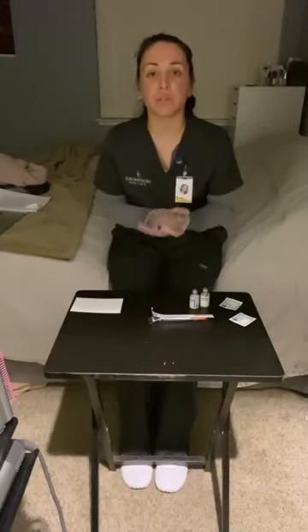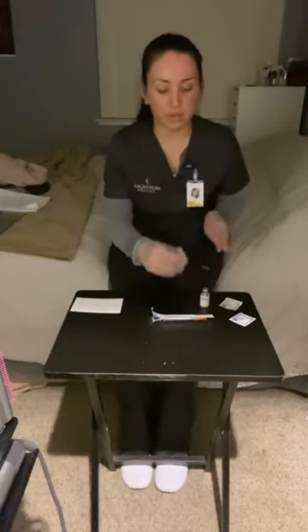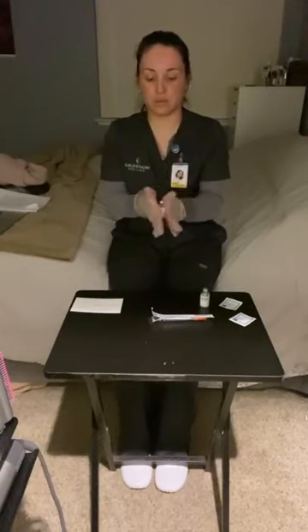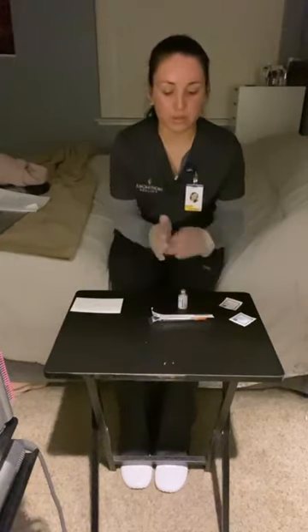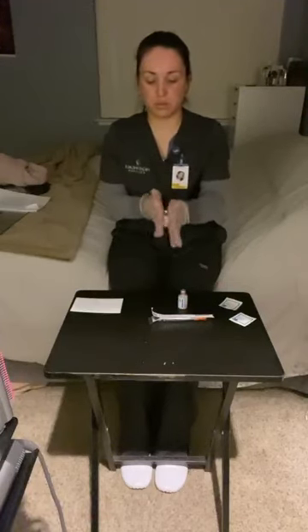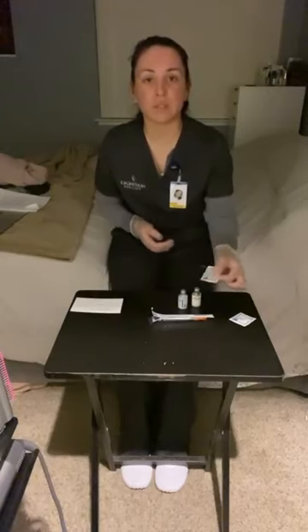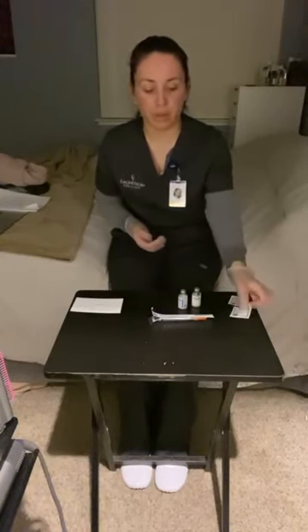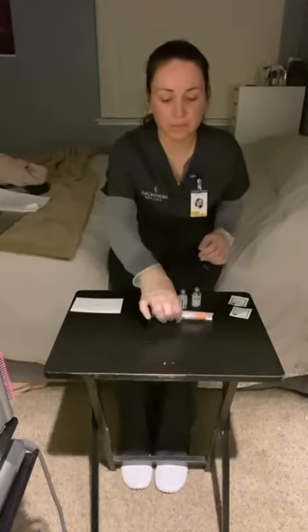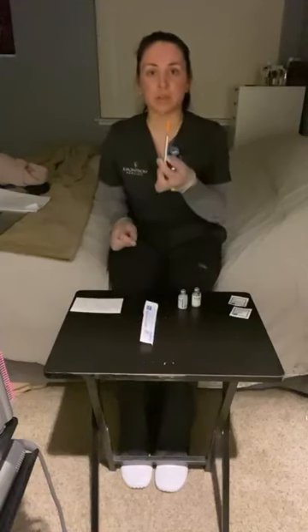Before that, I want to verify the orders in the MAR and EHR. I'm going to grab my vial. Do it to the next vial. And grab an alcohol swab, clean the top of the cap, grab a new alcohol swab and clean the top of the cap. Next, I'm going to go ahead and grab my syringe and needle with the cap still on.